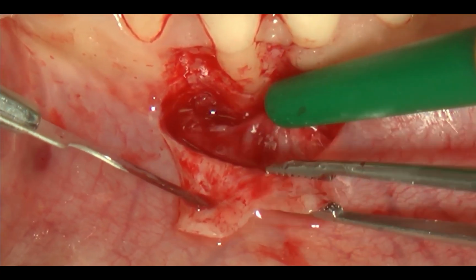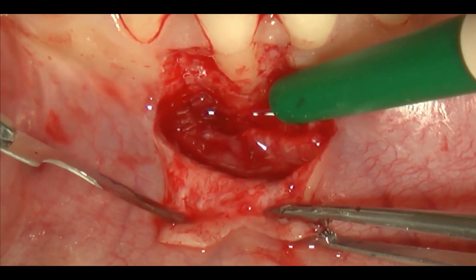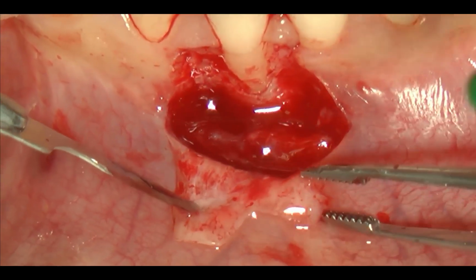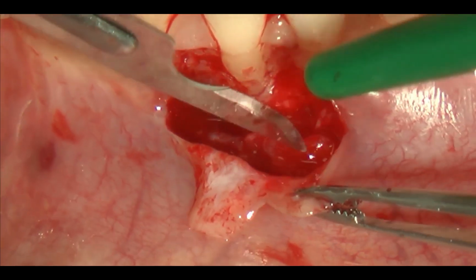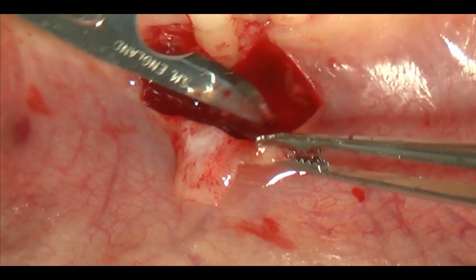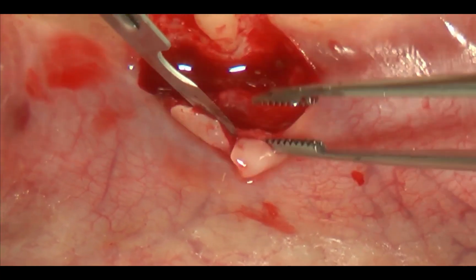The problem in this area is that this submucosal tissue is so coronally displaced due to the absence of the vestibulum depth that it's so close to the flap that you risk immediate shrinkage of the flap once it's coronally advanced.